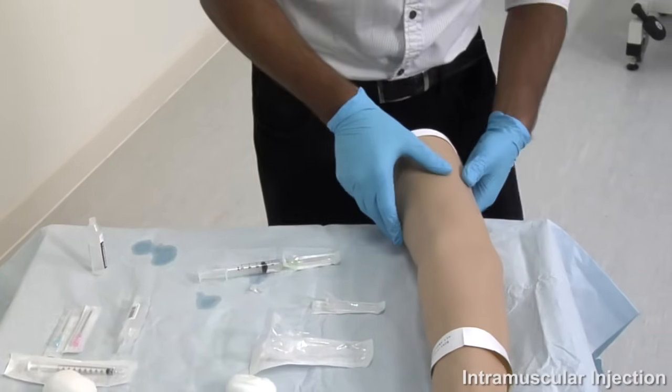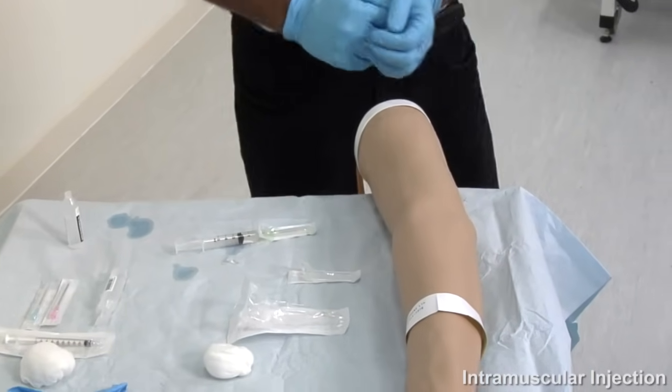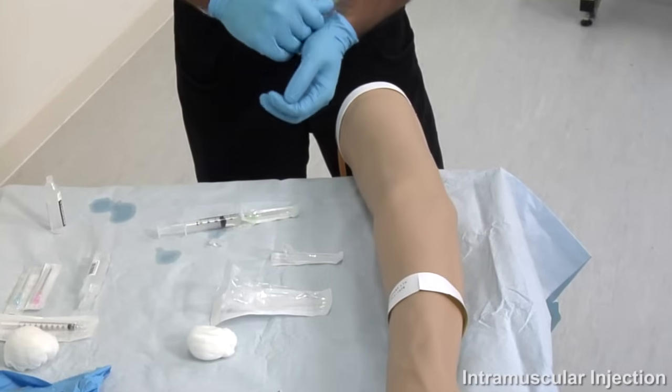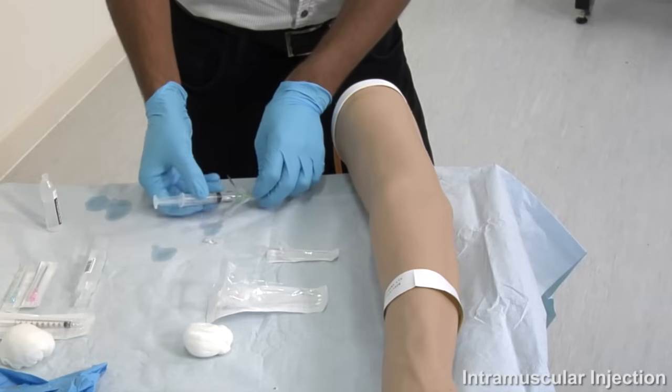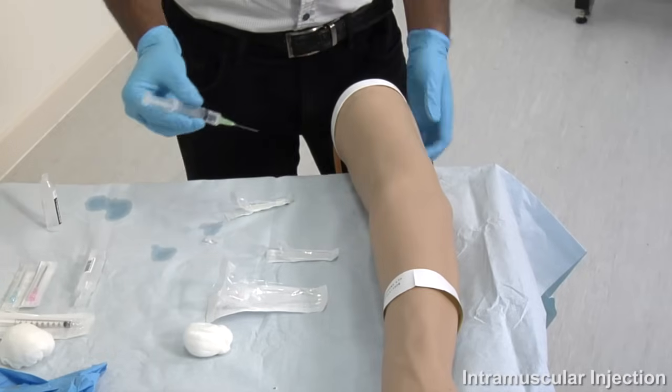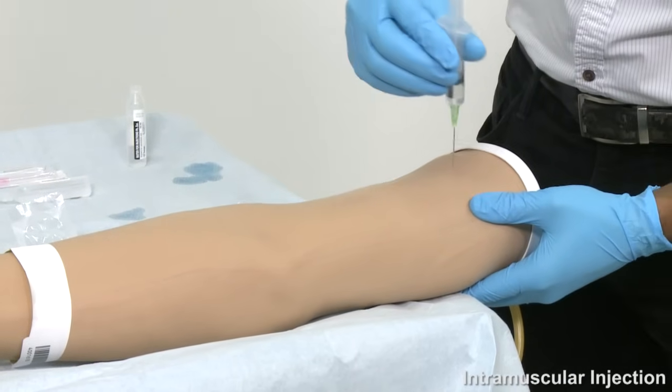Stabilise the skin with your non-dominant hand. Current best practice suggests that it is not necessary to cleanse the target skin area with an alcohol wipe, provided the patient is clean. With your dominant hand, hold the syringe as though you would hold a dart and insert it into the skin at 90 degrees, almost to the hilt of the needle.